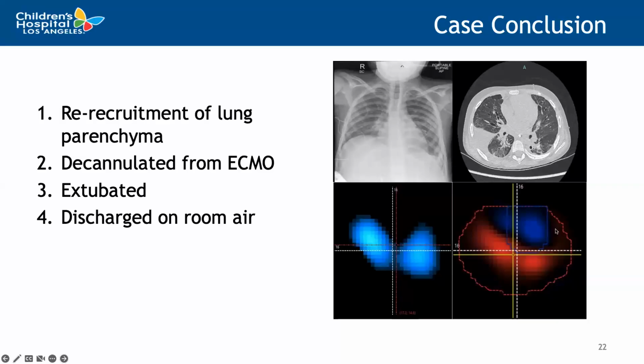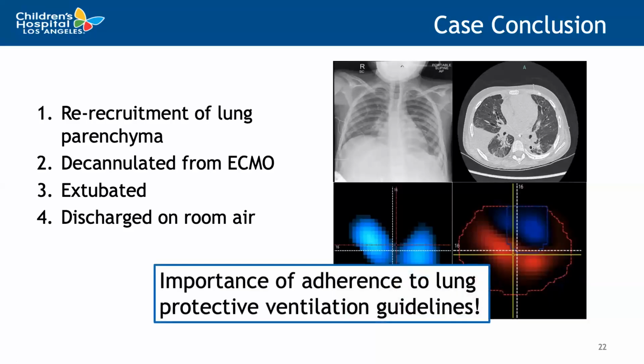And so not only does this case highlight the importance or the role of EIT for monitoring at the bedside, both ventilation and perfusion inhomogeneity and guiding clinical practice, but it really drives home this point of adherence to lung protective ventilation strategies and guidelines.